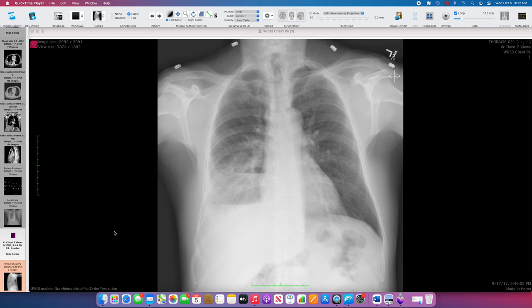Dr. Christian Cox, and for this case, we're going to review Thoracic 21. In this patient, they're presenting with cough and shortness of breath, middle-aged adult.